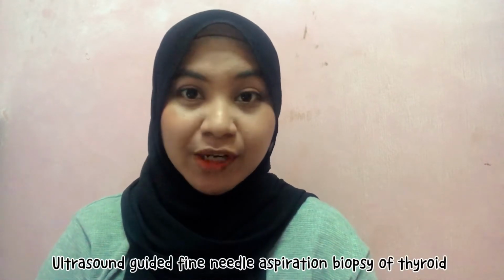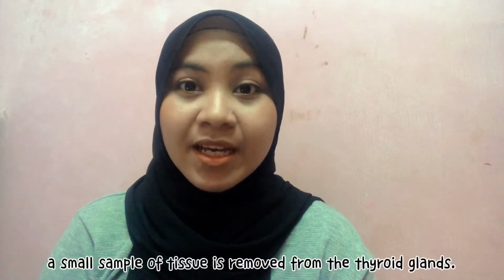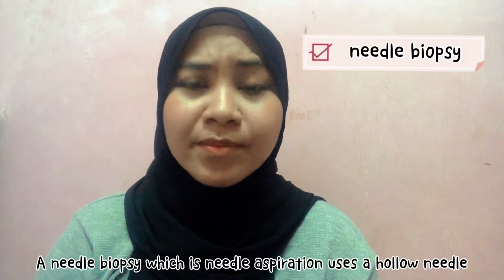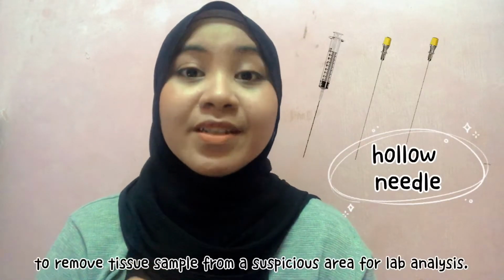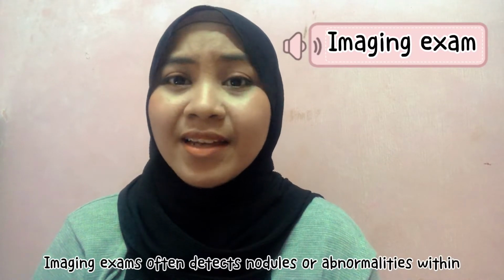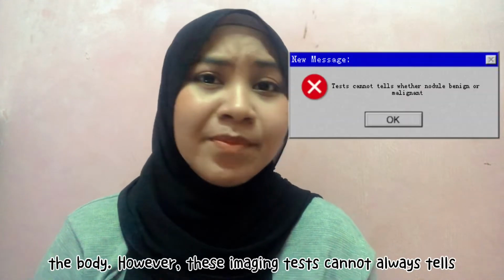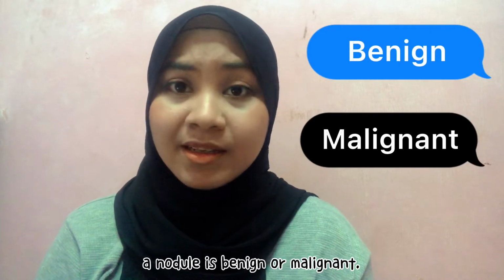Ultrasound guided fine needle aspiration biopsy of the thyroid. During a fine needle aspiration biopsy of the thyroid, a small sample of tissue is removed from the thyroid gland. A needle biopsy, which is a needle aspiration, uses a hollow needle to remove a tissue sample from a suspicious area for lab analysis. Imaging exams often detect nodules or abnormalities within the body. However, these imaging tests cannot always tell whether a nodule is benign or malignant.